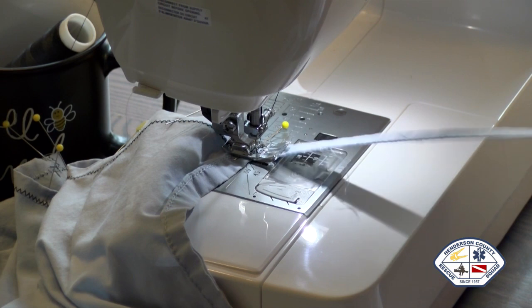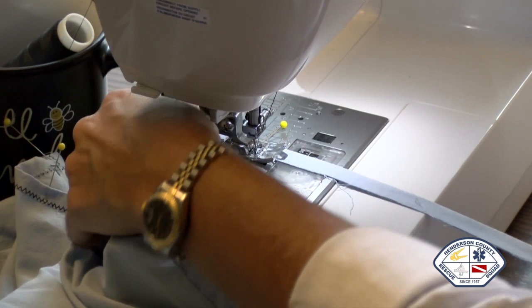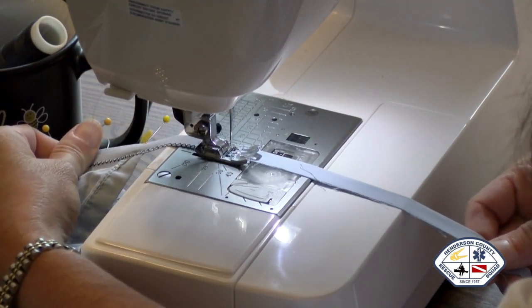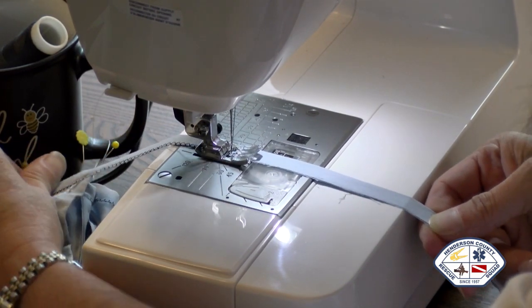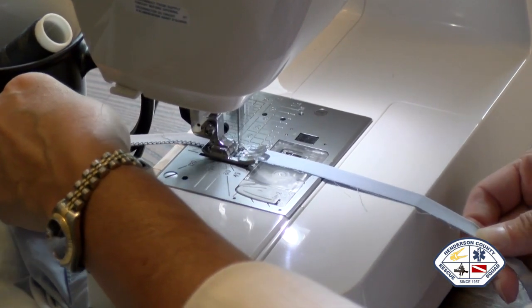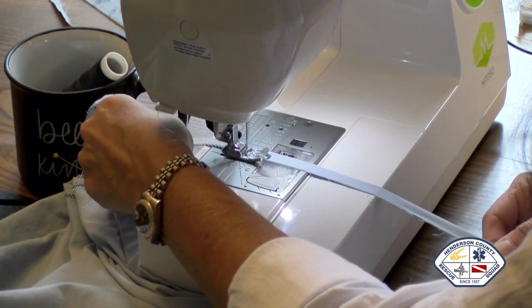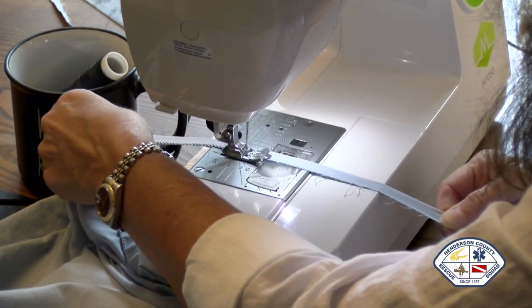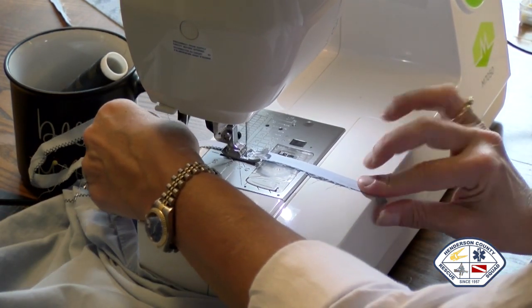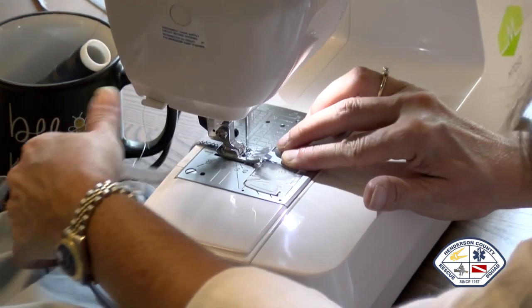Now, this leftover part is what you're going to use as your tie at the neck. So, I didn't on the other end yet, but go back and let's zigzag that shut. There again, it lets us have a little bit more stability, and it keeps the fraying to a minimum. And I didn't want to start on the other end, just for the sake of time. But we're going to go back and make sure both ends are done.